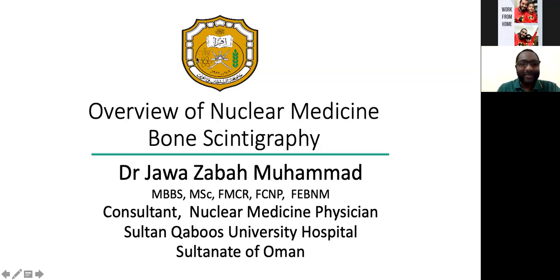Today, the title of my presentation will be an overview of nuclear medicine, and then I will take some time to discuss bone scintigraphy. So I'm giving two presentations at a time, but I think it's important to give an overview so that my audience, and particularly registrars, will understand the very basic principles of nuclear medicine.